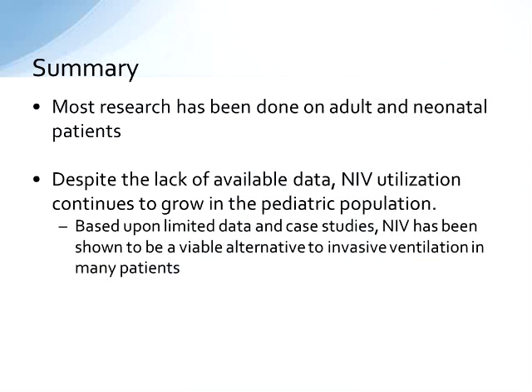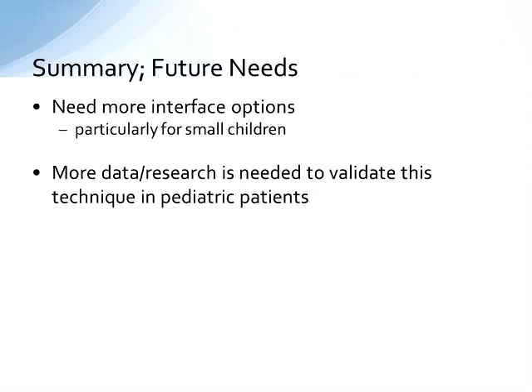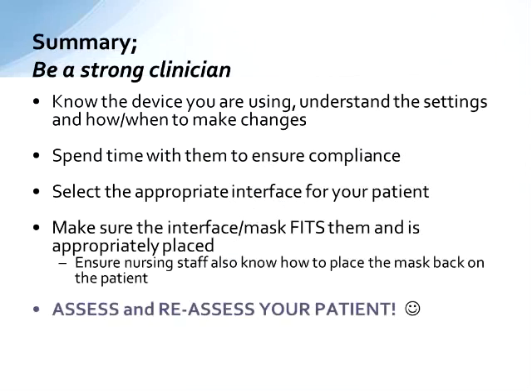So in summary, most of the research on non-invasive ventilation has really been done on adults and neonates. Very little data is available on peds specifically, but despite that fact, we are using it in lots and lots of ICUs around the country, and it has been shown to be a successful option, a viable alternative to invasive ventilation in many kiddos, and facilitates extubation. I think we absolutely need more options for interfaces in these children, particularly for that pre-K toddler age. And we need more data. This is a call to action, if you will. We need more research to be completed to validate this technique and to look at different modalities for these kids.